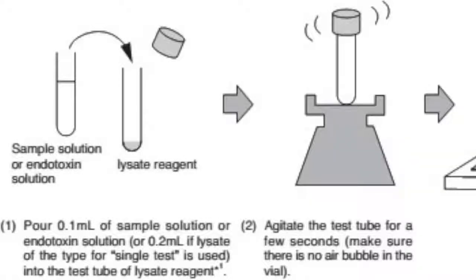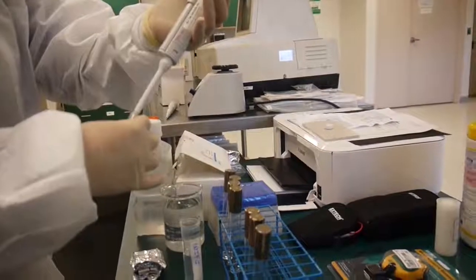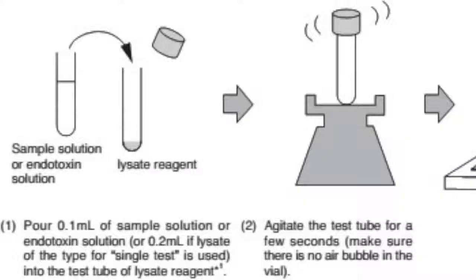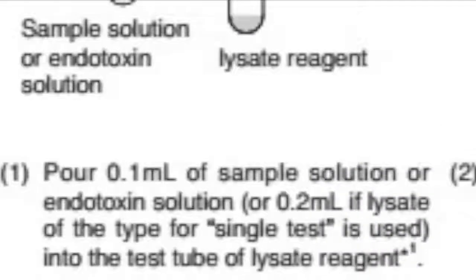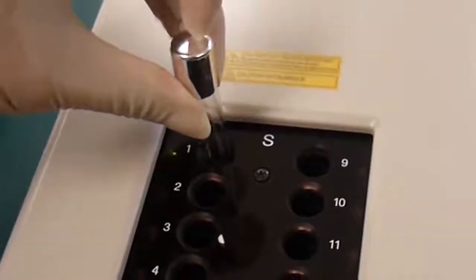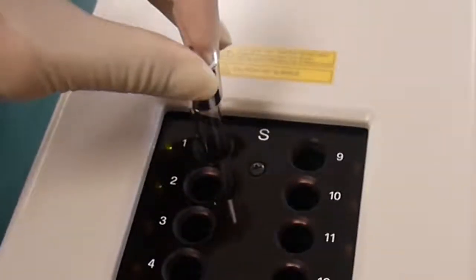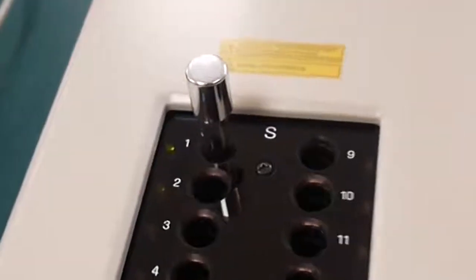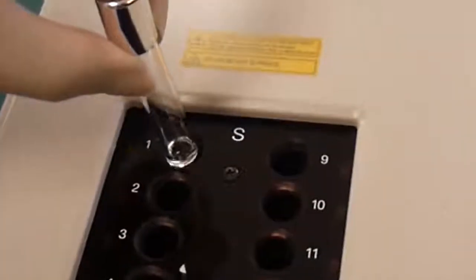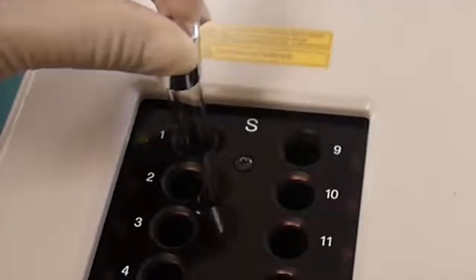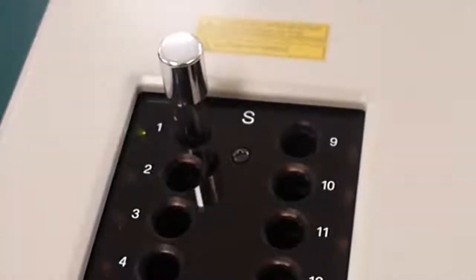Our sample or endotoxin solution will now be combined with the lysate reagent to begin the reaction test. Please note the difference of solution added to the lysate reagent based on the single or multi-test use. With our samples now prepared, we will place the test tubes within the toxinometer. Note after each tube's insertion, the beep, as well as the blinking light in the next position.